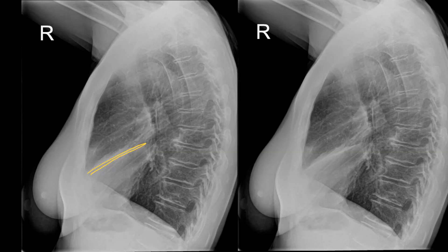The lateral film shows a very thin white line, which is the apposition of the horizontal and oblique fissures with this very tight middle lobe collapse.